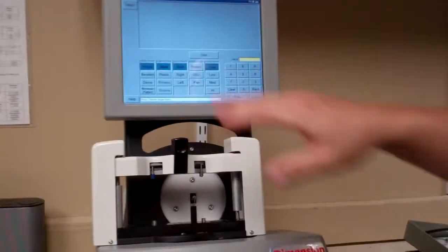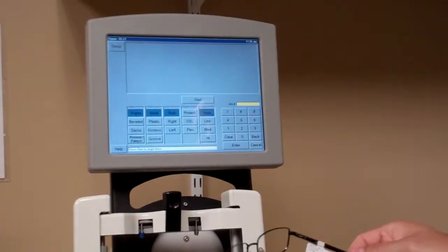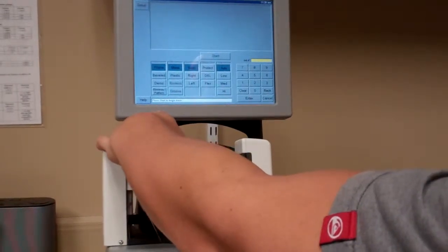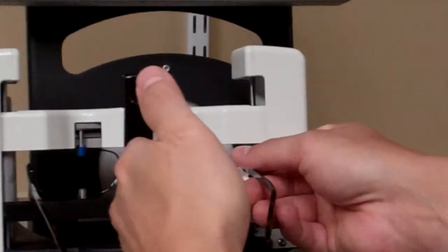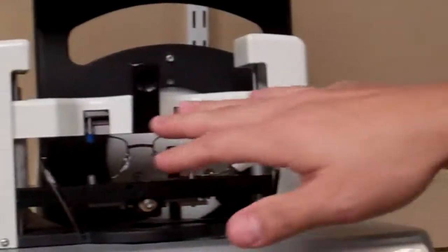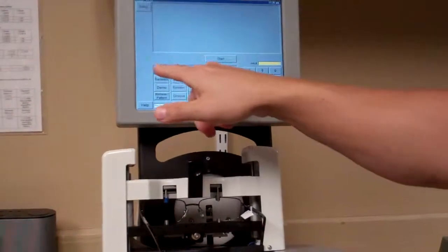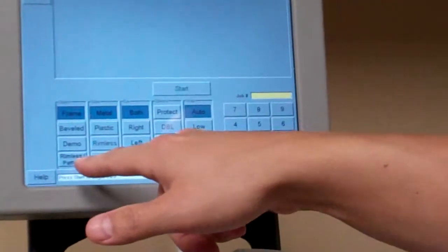So here we're on the home screen. You're going to go ahead and get your metal frame and clip it in top and bottom. You want to kind of eyeball it — you don't have to get out a PD stick and try to get it exactly in the center, just get it as close to the middle as you can. Once it's clipped in, you can see the first set of options here: frame, bevel, demo, or rimless pattern.